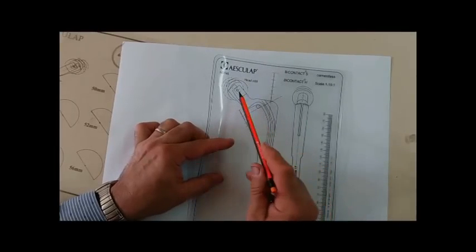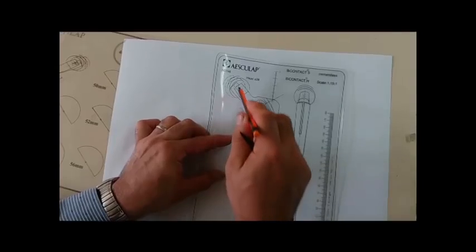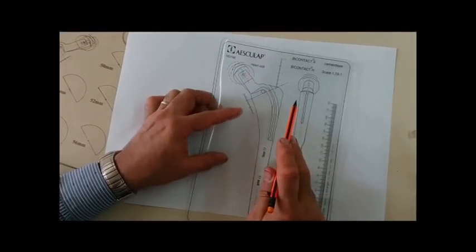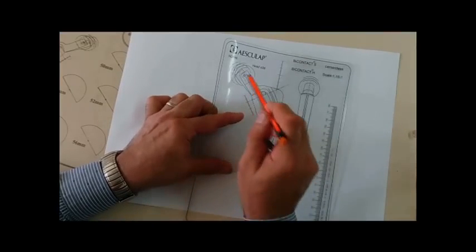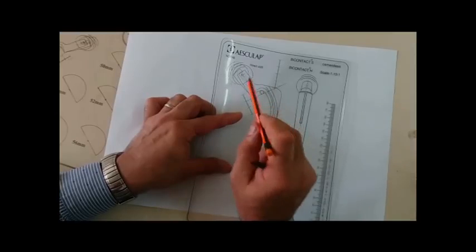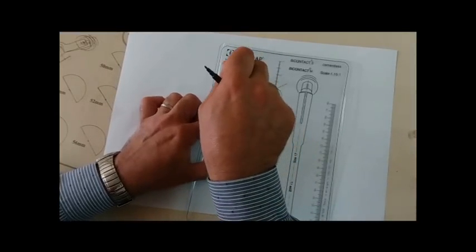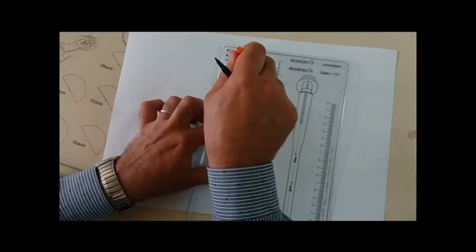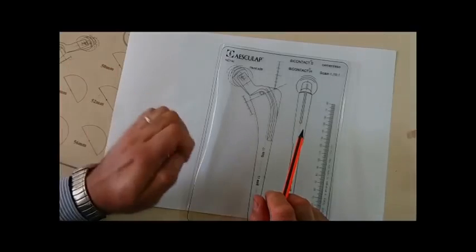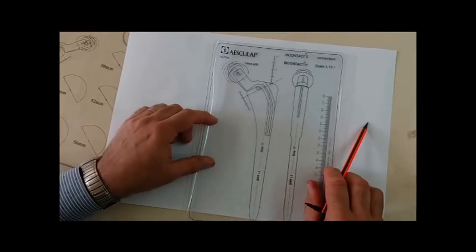These dotted circles or small openings indicate the center of rotation for the hip, for the stem. For example, in my templating, I will strongly depend on these small circles. When I put my pencil here, I mean that this center of rotation would be in the future for the stem. I will try to explain it in more detail while I am doing the tracing.